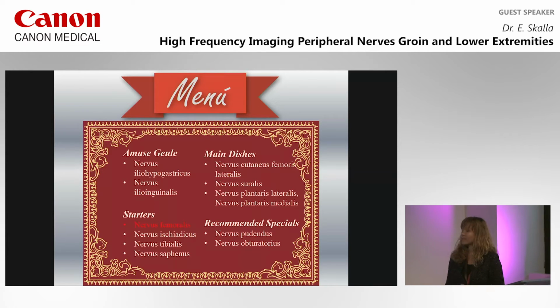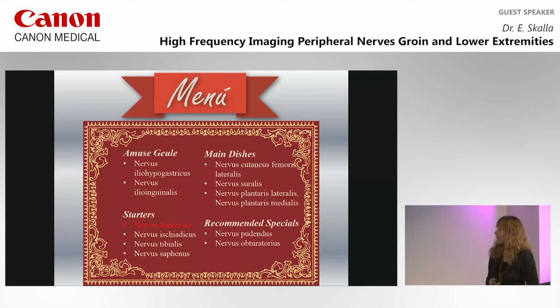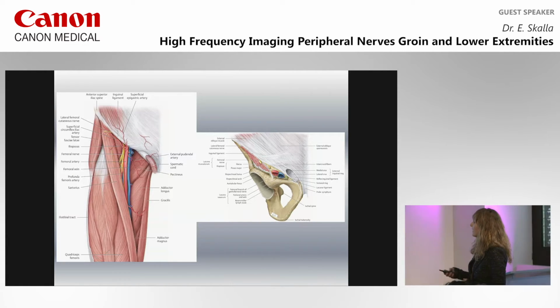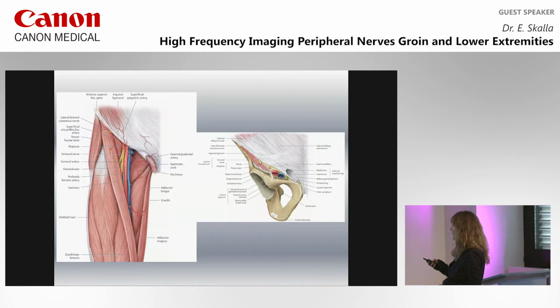So let's go over to the starters. Something we have heard often of is the femoral nerve, a big nerve. And it exits the pelvis. It runs under the inguinal ligament here.